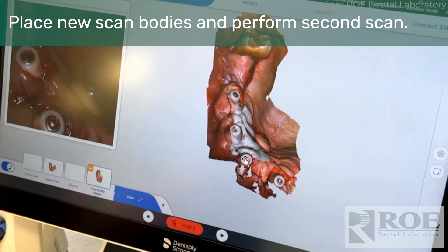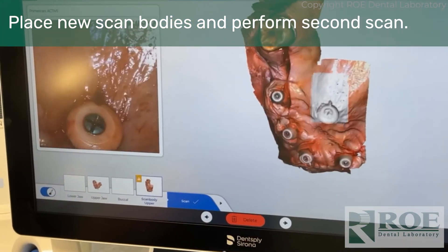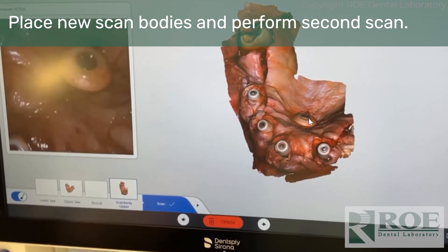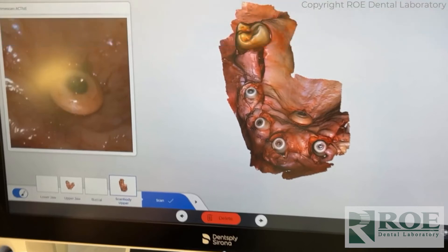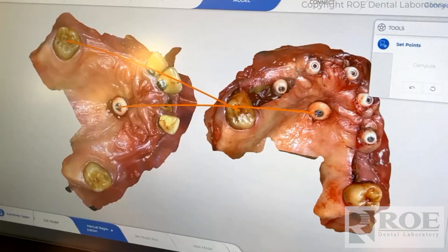The scan bodies are seated and the patient is sutured. At this point, the doctor will scan the mouth capturing the scan bodies and the palatal tab. This is important because the palatal tab will reference back to the pre-surgical tab. The scans — pre and post surgery — are shown here. Points are taken and matched in a registration process, just like any digital registration where you set points, and then the two scans merge together.